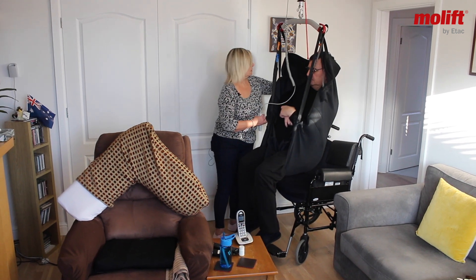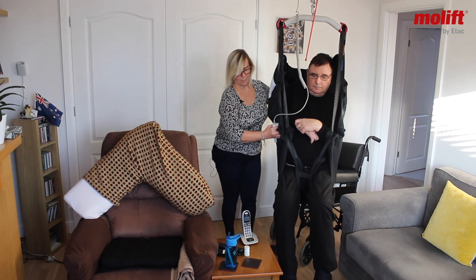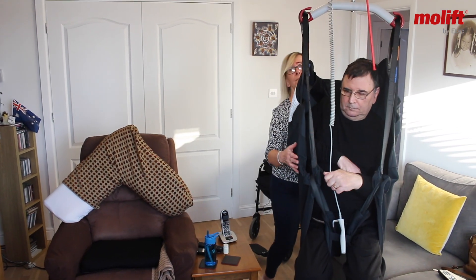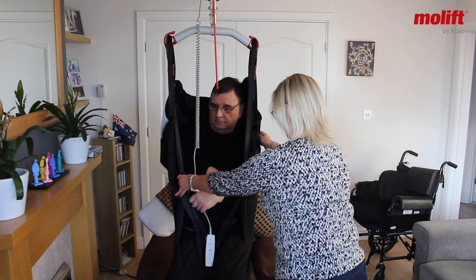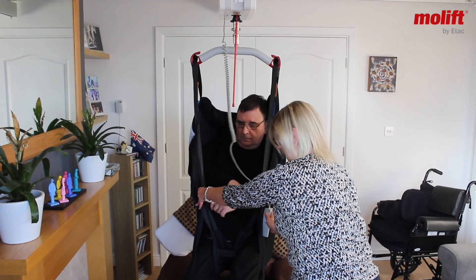Now what I'm going to do is just push Philip round and get him lined up with his rise and recliner chair. And then from this position we can lower Philip down.